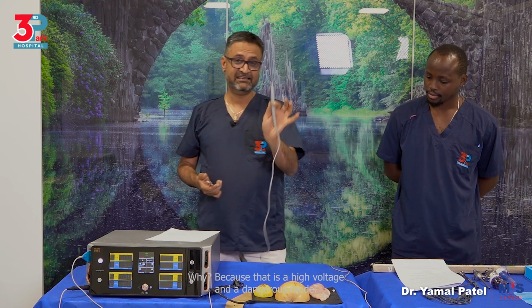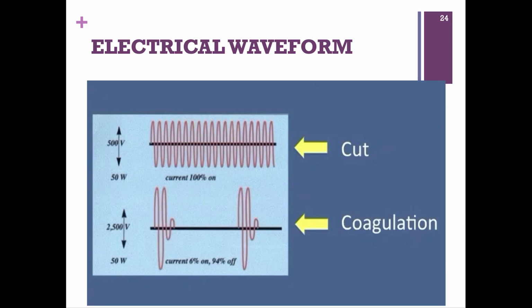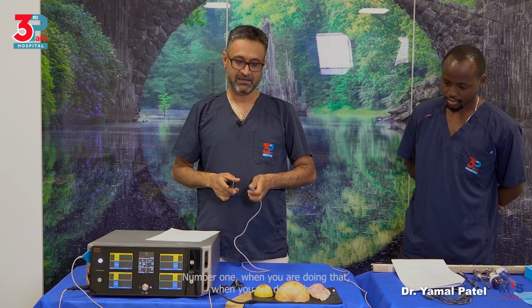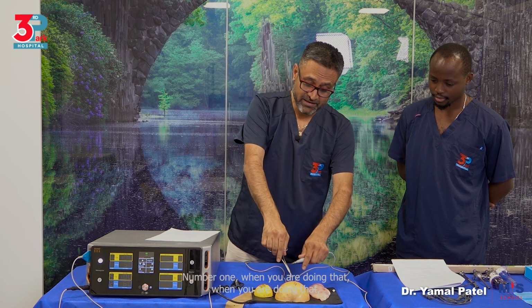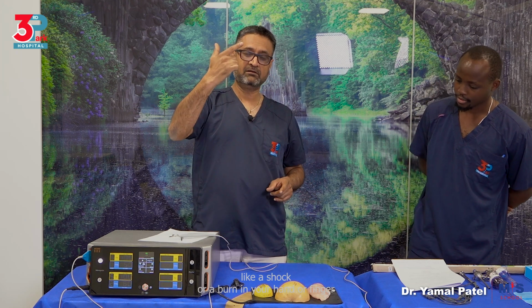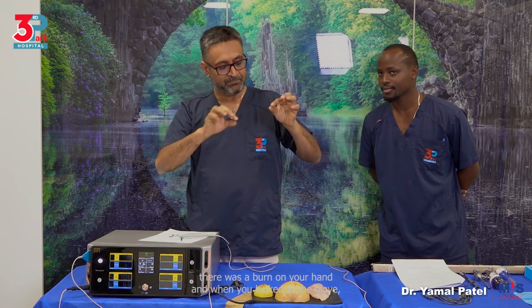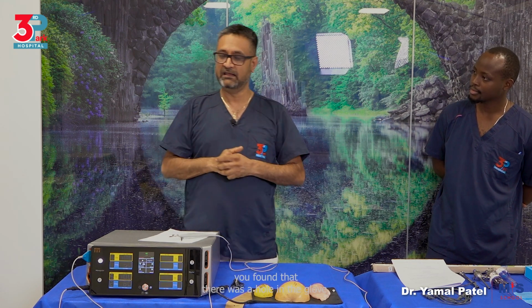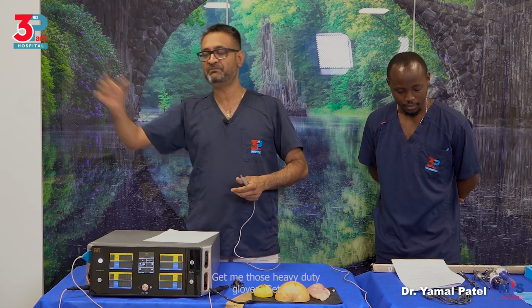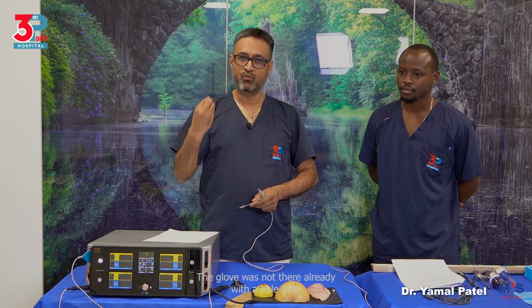Why? Because that is a high voltage and a dangerous mode. If you remember what I said, it's like a lightning strike, on and off. So let me give you a scenario that I believe most of you would agree with. How many of you have experienced a sudden shock or a burn in your hand or finger, and then you removed your glove only to realize there was a burn on your hand, and when you looked at the glove, you found that there was a hole in the glove? The next thing you would say is, look, these are poor quality gloves. Next time, don't give me such gloves, get me those heavy duty gloves. The issue was not the quality of the glove. The glove was not already there with a hole in it.